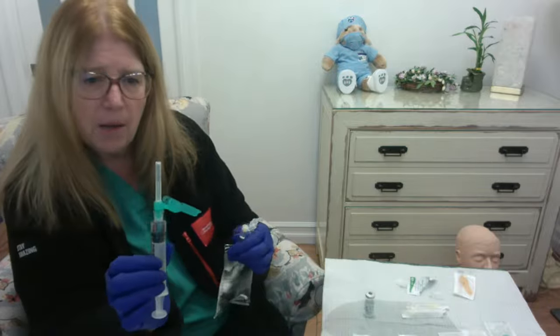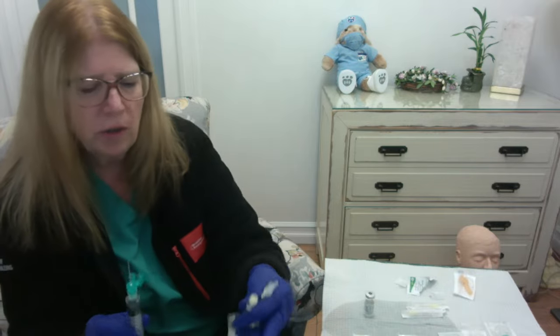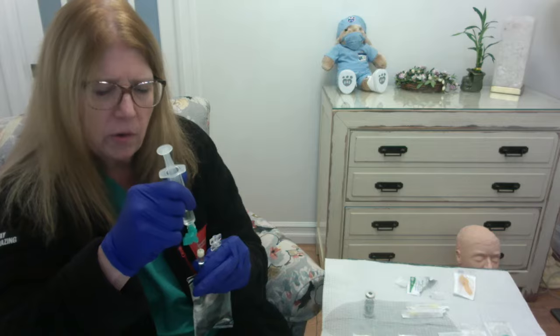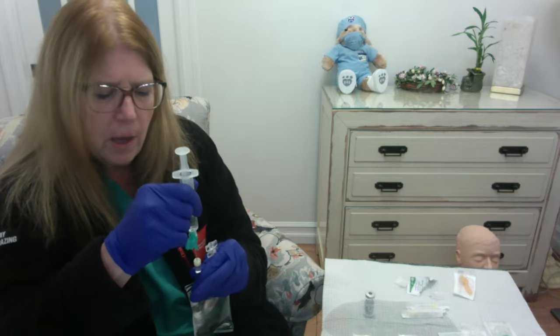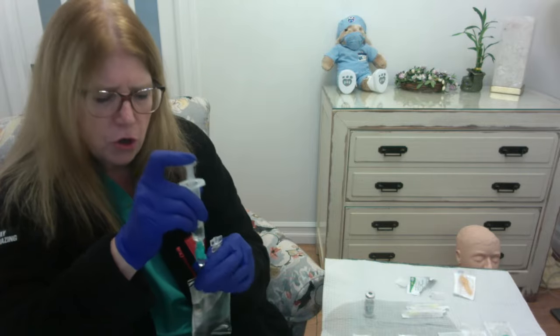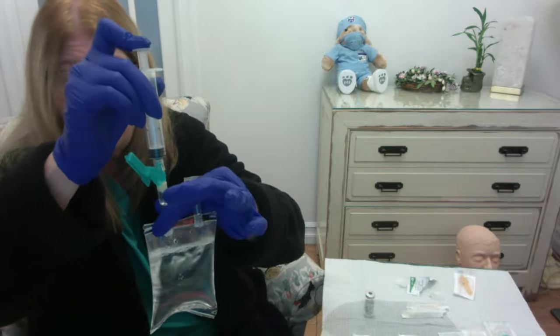I'm going to take my syringe. I'm going to pull off my cap. Remember, no twisting, just pull. And I'm going to aim this needle right into the center of the bullseye, push it in, and then inject my medication into that vial, into that bag.